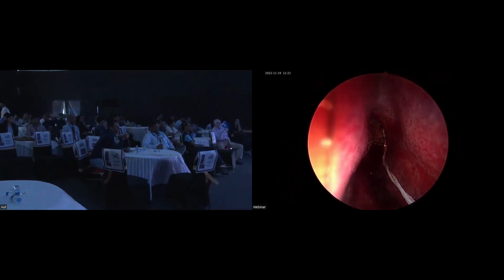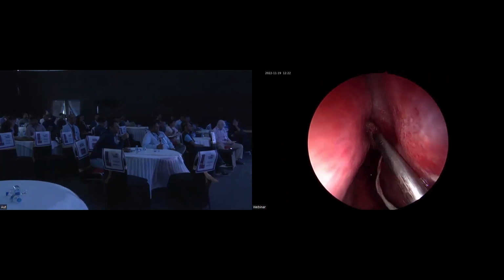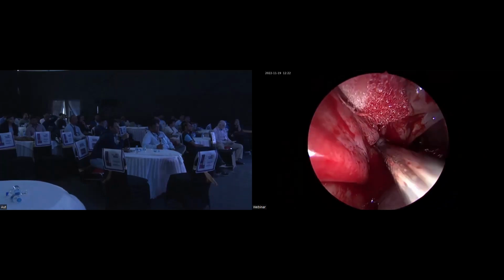Suction number 70. Can I have the angle suction also? Double go.